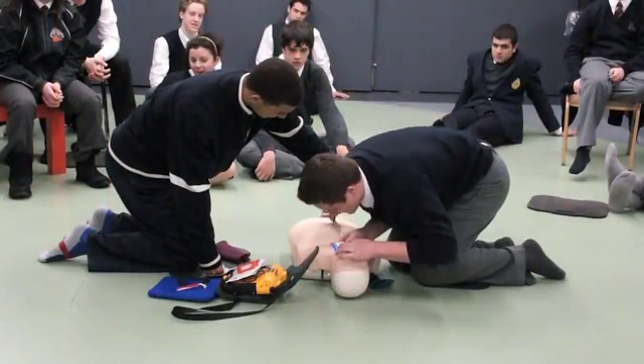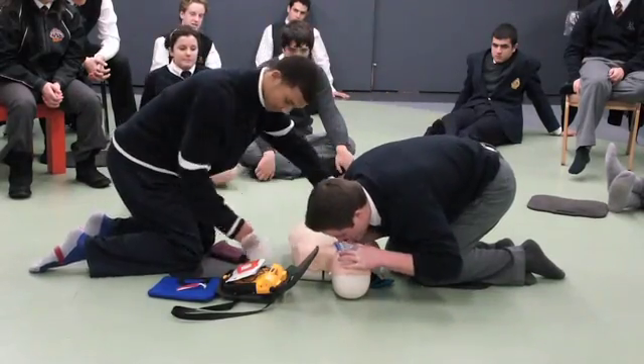Okay. Open the airway. Good, keep breathing.